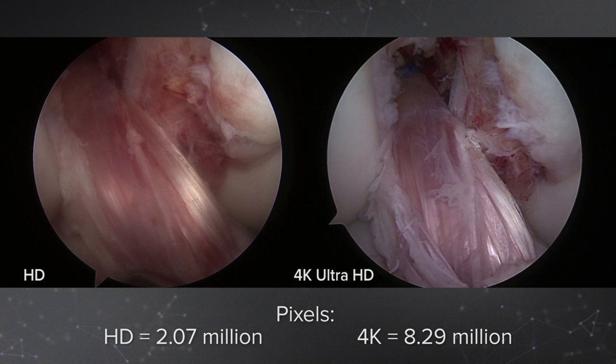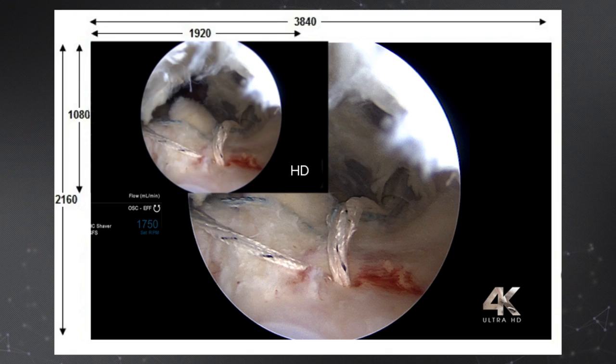This topic brings up the debate about how much resolution do you really need in arthroscopy. Are we pushing the envelope to a place that is not needed? I say the answer is no.